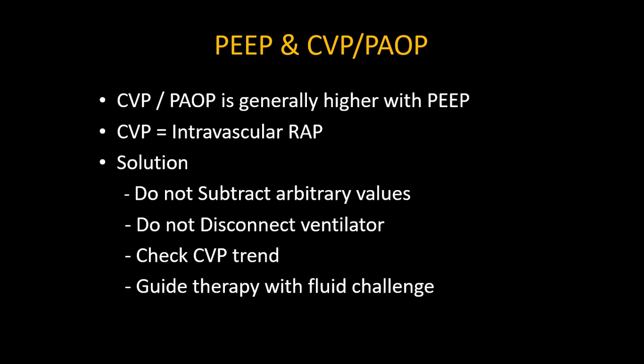Do not disconnect the ventilator, because if you feel that you will mitigate the effect of the PEEP, just disconnect the ventilator, it may cause much more problem than the benefit. Patient may de-recruit at that time. Check the CVP trend, do not rely on a single value, and guide therapy with a fluid challenge.